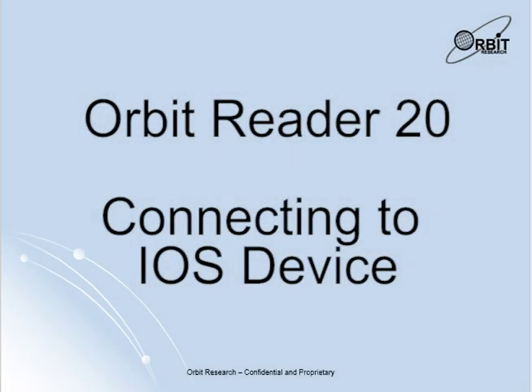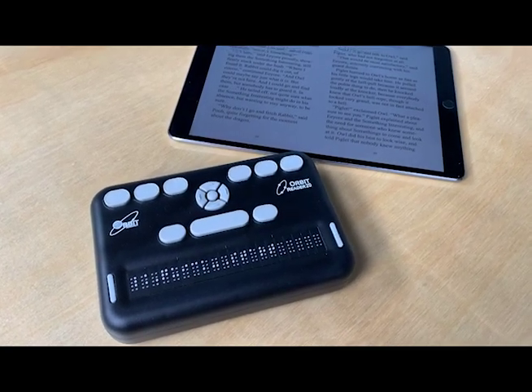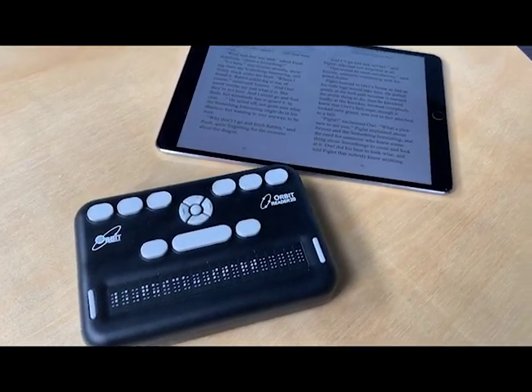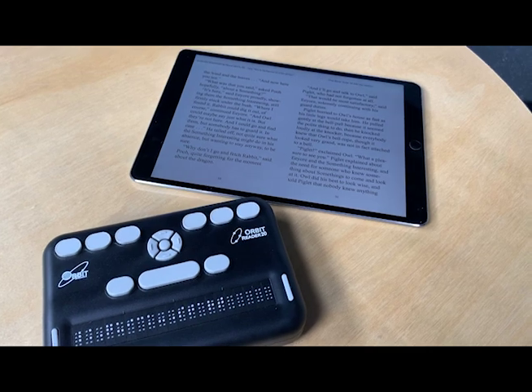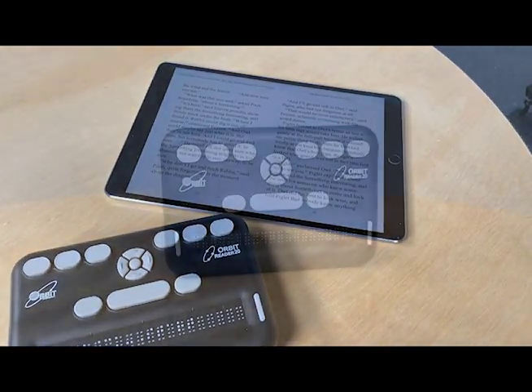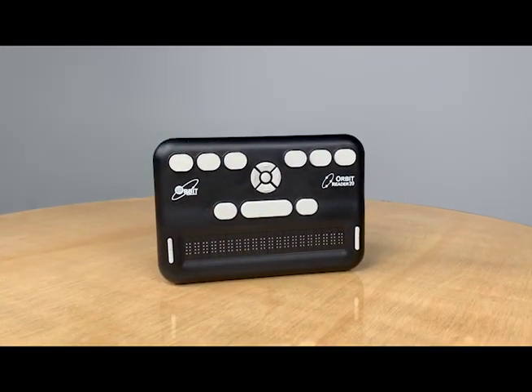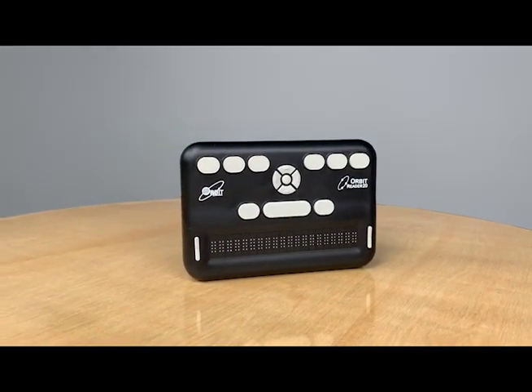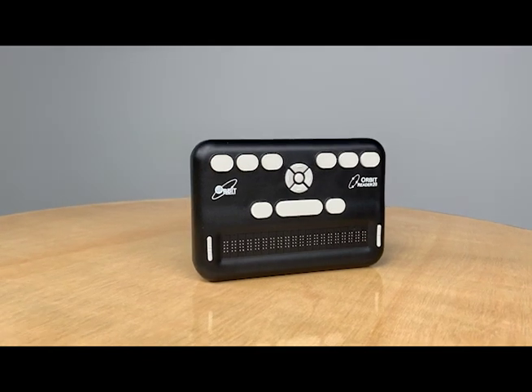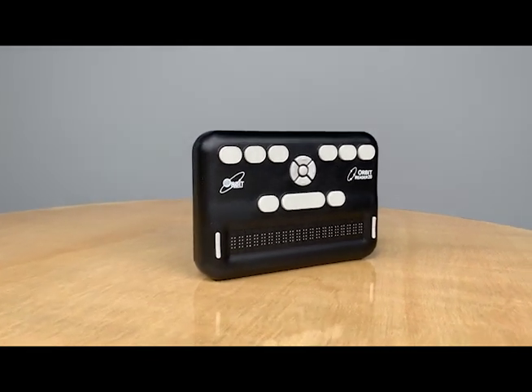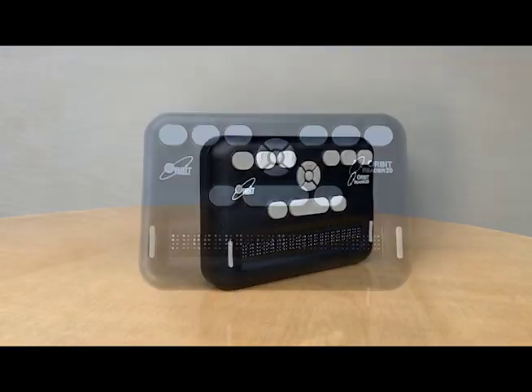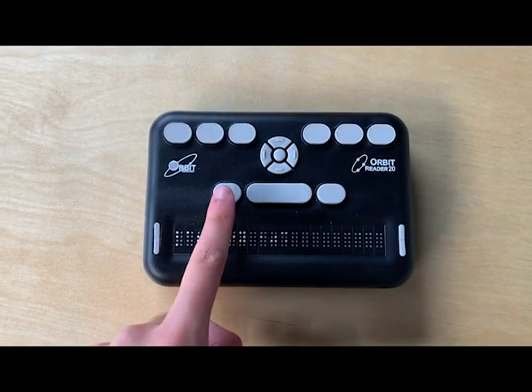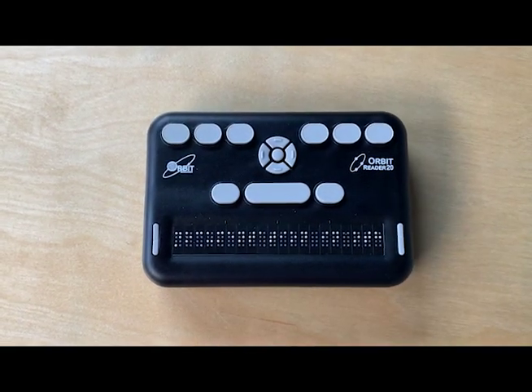Hello and welcome to the Orbit Reader 20 connecting with an iOS device video. Today I will be going over how to pair your Orbit Reader 20 with any iOS device over Bluetooth. Using your Orbit Reader 20 with any iOS device provides you both braille feedback and the ability to type and control the iOS device with your Orbit Reader 20.